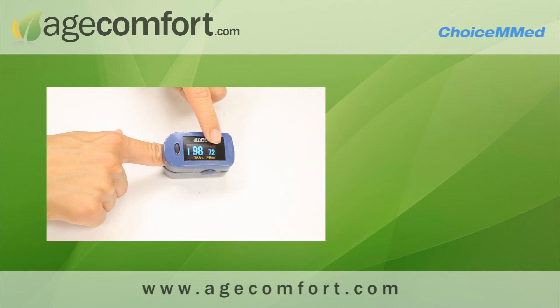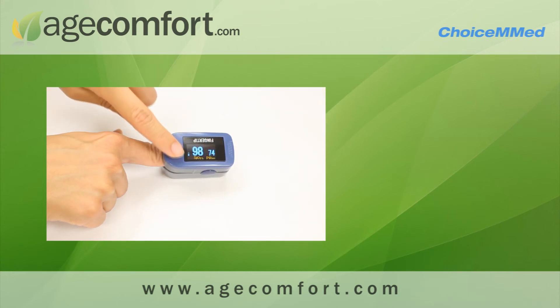This number here is your pulse rate, showing how many times per minute your heart beats. The blue bar here fluctuates, giving you a visual representation of your heartbeat.